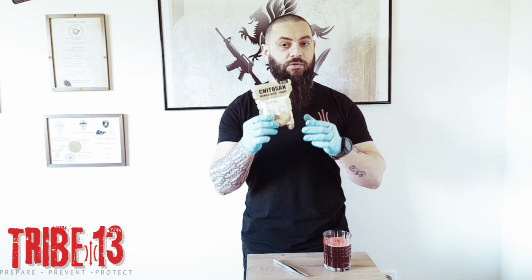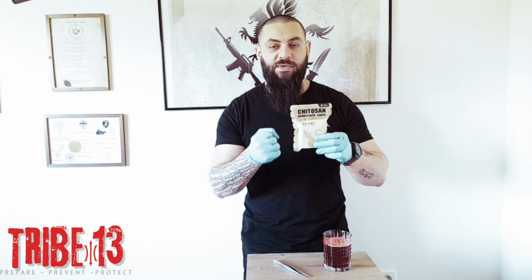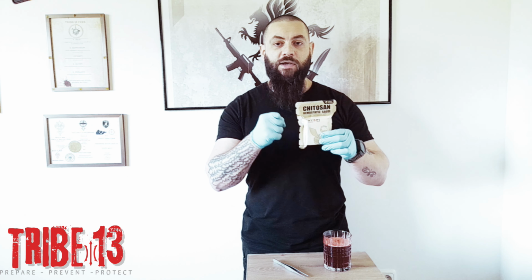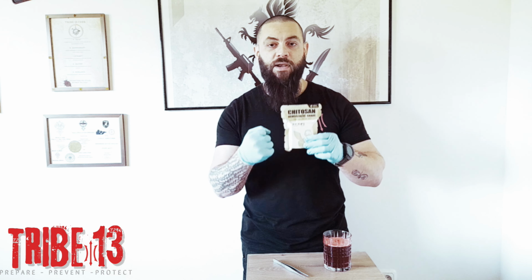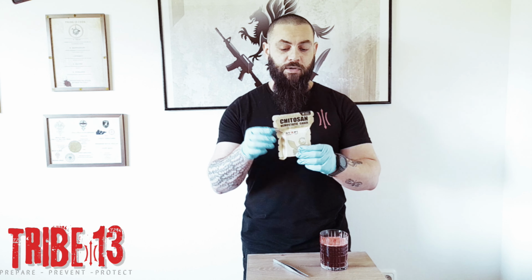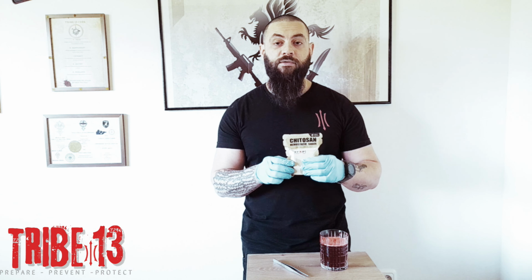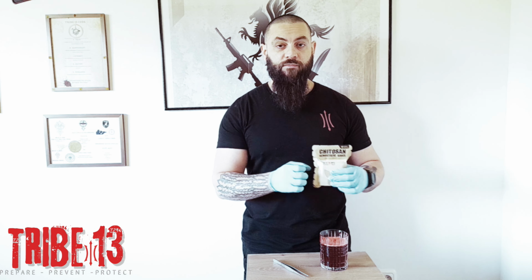The hemostatic gauze is a gauze that is impregnated with a chemical agent, and that chemical agent is helping the blood to clot faster, to coagulate faster. I will put the hemostatic gauze inside to see what is the result.